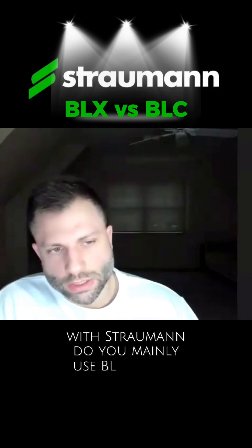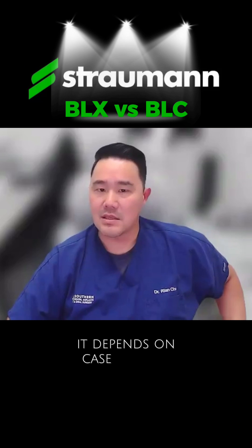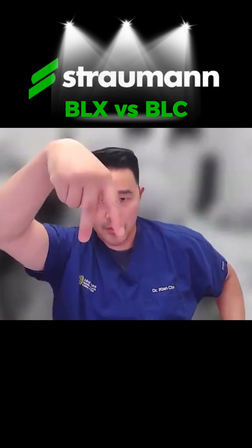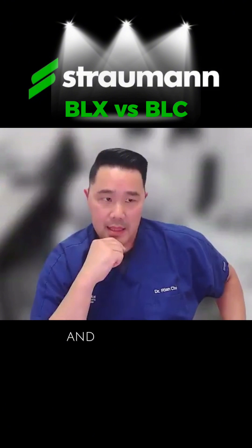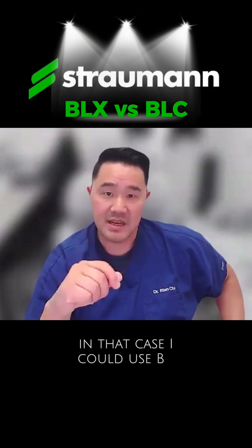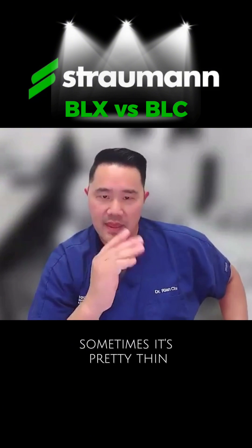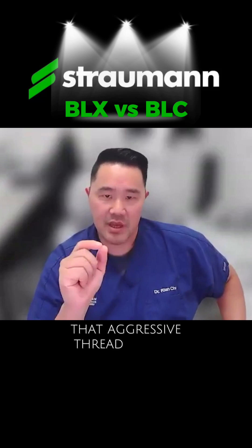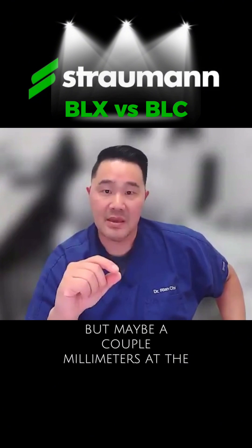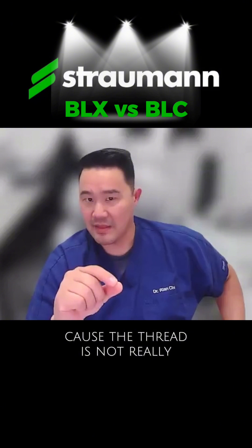With Straumann, whether to use BLC or BLX depends on the case. For the first mandibular molar, there's bone between the roots that can sometimes be pretty wide and thick — in that case I could use BLX to engage a little more. But sometimes it's pretty thin, and that aggressive thread would completely destroy it, leaving maybe just a couple millimeters at the apex to engage, which often isn't enough because the thread isn't really there.